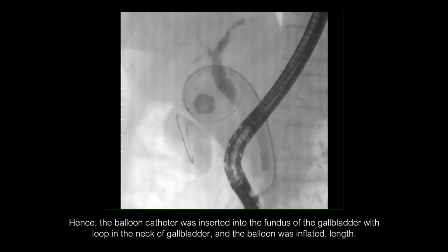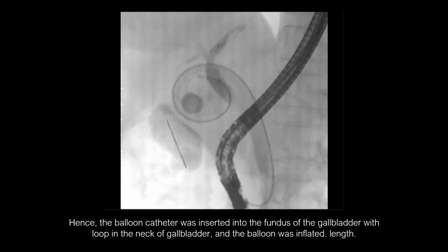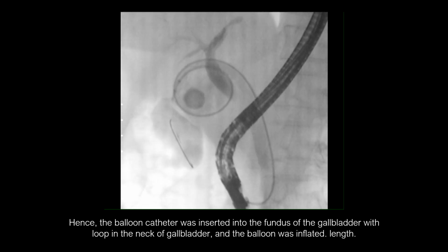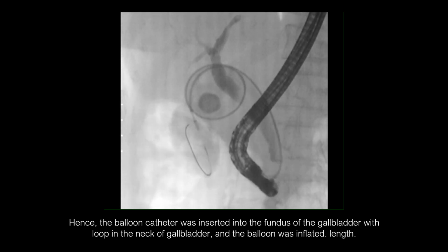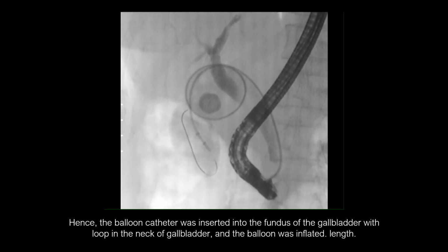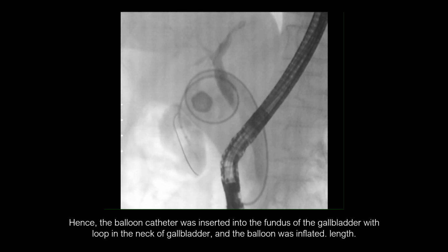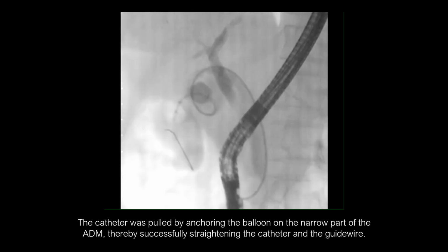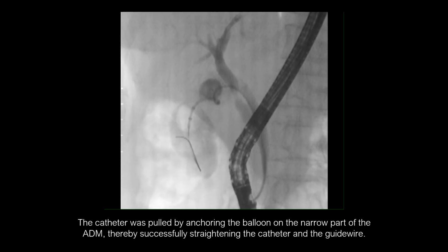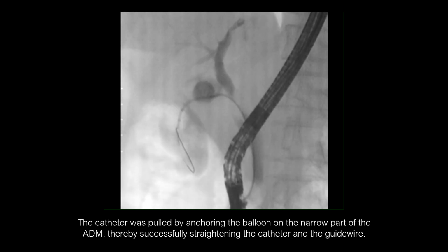Hence, the balloon catheter was inserted into the fundus of the gallbladder with the loop in the neck of the gallbladder. And the balloon was inflated. Then, the catheter was pulled by anchoring the balloon on the narrow part of the adenomyomatosis, thereby successfully straightening the catheter and the guide wire.